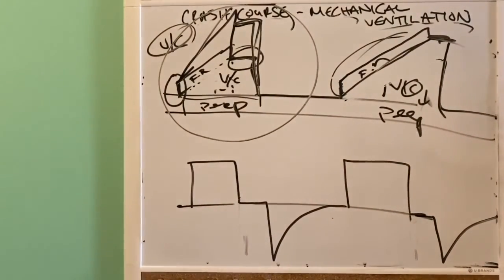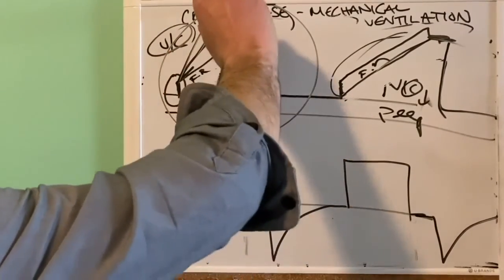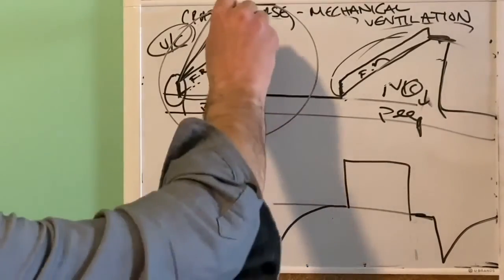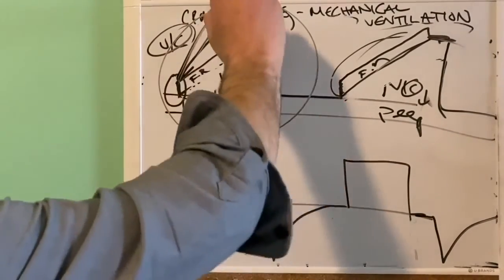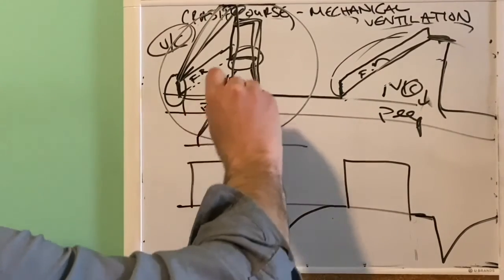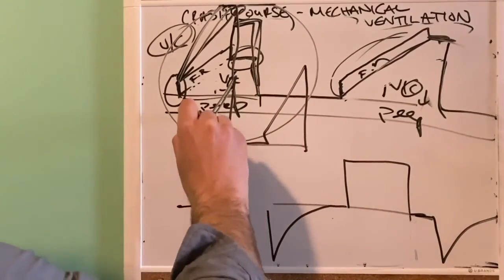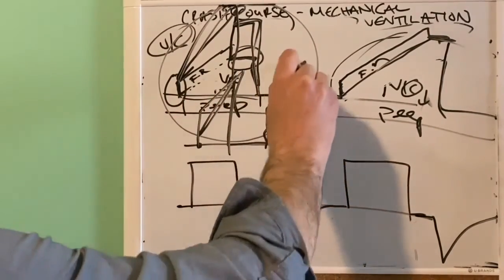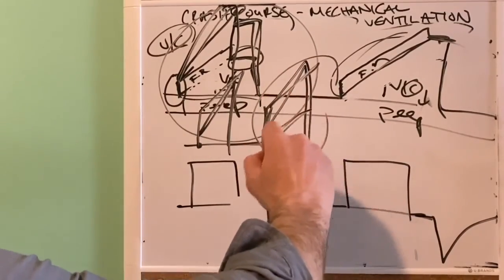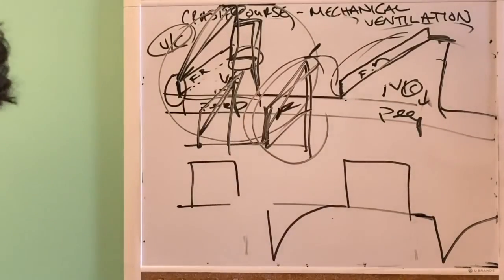And if you see across the room, you should hear your peak inspiratory pressure will go up, but if this is shooting up, let's say you don't have a break here and this just comes down, but you see this is shooting up, and all of a sudden, you're looking across the room and you see what looks like this, or really this would be higher. Let's say you see this, then you know that there's a tremendous amount of resistance, all right, and your peak pressures will alarm. All right.